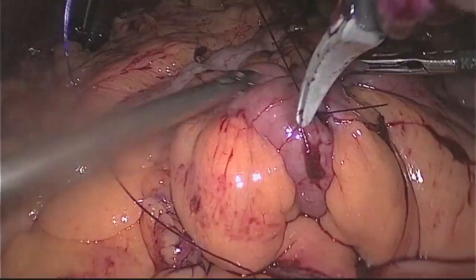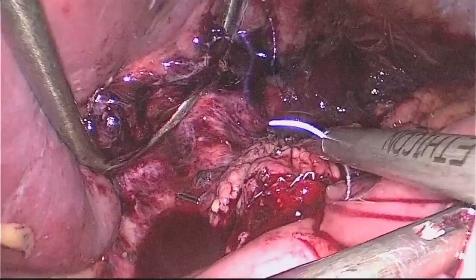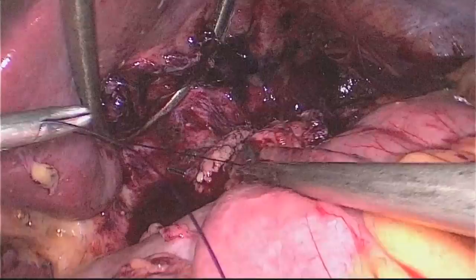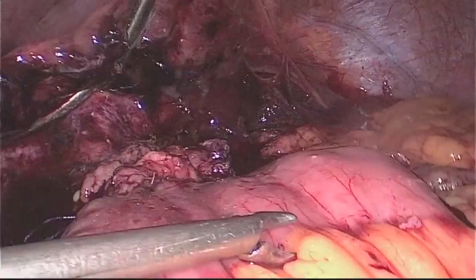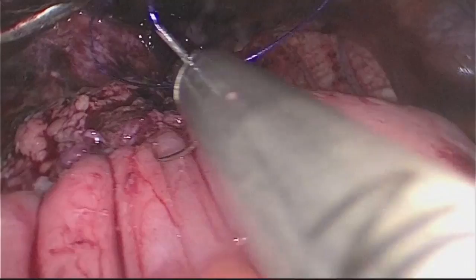Upon further evaluation of the staple line, staples were noted to be loose and opening. Any loose staples were removed, and the entire staple line was incorporated into our first layer of a two-layer hand-sewn gastrojejunostomy. Ensuring minimal tension on the Roux limb, a gastrostomy and enterostomy were created. The remainder of the gastrojejunostomy was then performed.